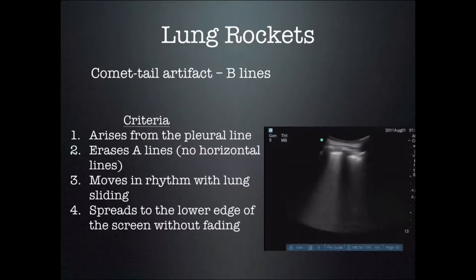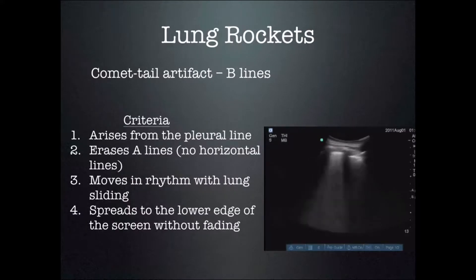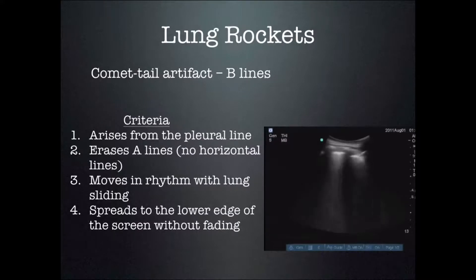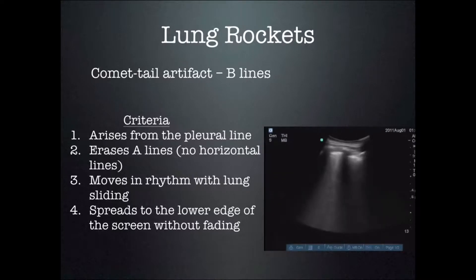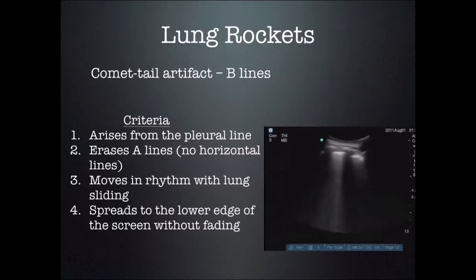To be a comet tail artifact — meaning there is an air-water interface in the lungs or true B-lines — you must meet certain criteria. First, the artifact, these lung rockets, these vertical lines, must arise from the pleural line. If they do not arise from the pleural line, they are not B-lines. There must also not be horizontal lines; in normal lung you can have a reverberation artifact with multiple horizontal lines going deeper on the ultrasound screen.